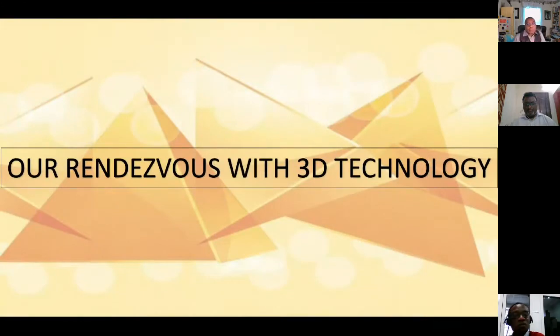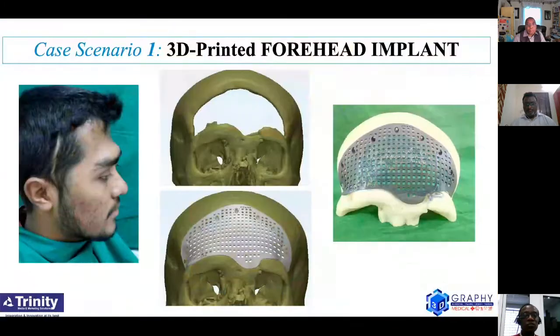When I go into 3D printing and 3D technology, I'm not going to waste much time. I'm just presenting a few cases of our rendezvous with 3D technology. This is a patient who came to us with a depression in the forehead, where the patient had met with a road traffic accident. At that particular time, the neurosurgeons called upon me and asked me whether I had a solution for this rather than the conventional bone flap. My colleagues here, Dr. Ganesh, Dr. John, and Arjun would understand in a larger diversity what I mean. So they were trying to understand whether they could get bone from the human body elsewhere.